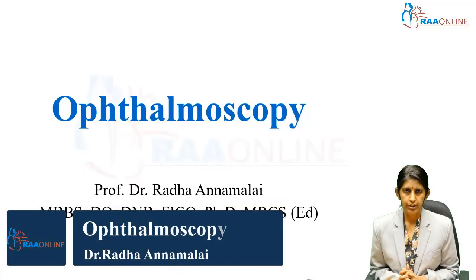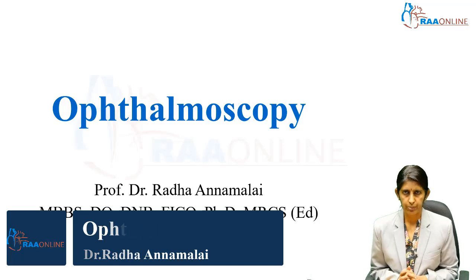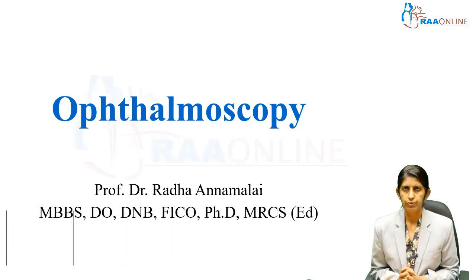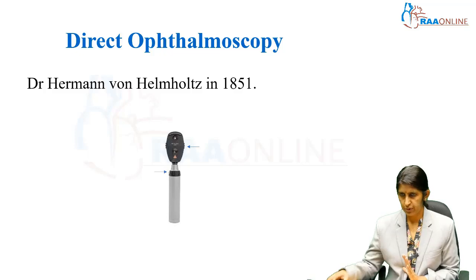Good morning. Today I'll be talking to you about a very important technique which is called ophthalmoscopy. It is important for us to visualize the retina in all patients on whom we are performing ophthalmic evaluation. So the direct ophthalmoscopy, this is what you're seeing here. It was first invented by Dr. von Helmholtz in 1851. So it's a very old instrument that's been used for a long time.